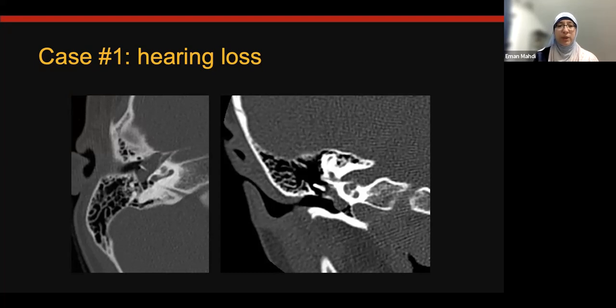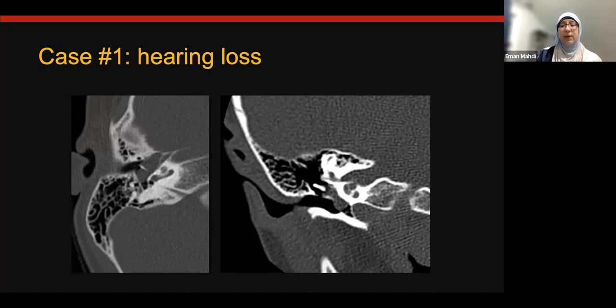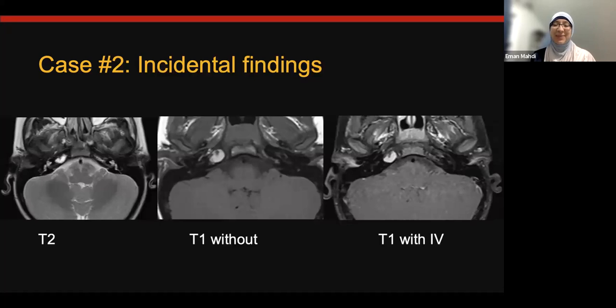Okay, so what do you think the diagnosis? Cholesteatoma. Okay. Well, I mean, we'll see through the talk. Next case. Thank you.